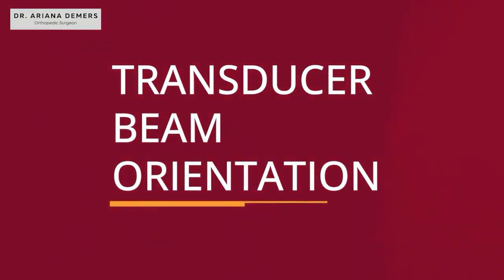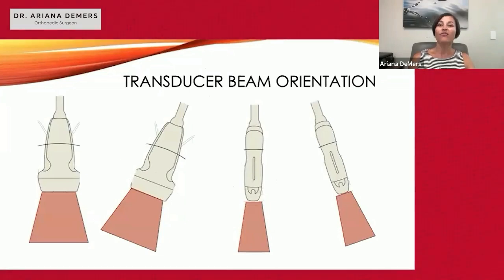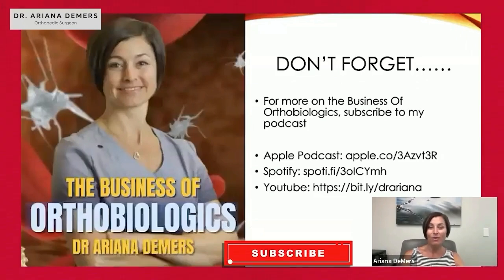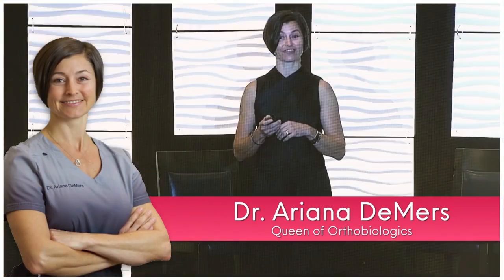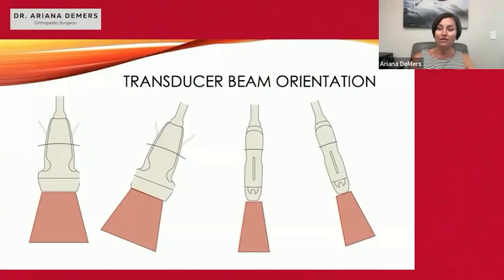I always think about the ultrasound probe as like a flashlight — this is transducer beam orientation. The linear probe is pushing sound waves out, and you can see in a clear path directly beneath the transducer, just like a flashlight. You shine the waves or the beam to the location that you're trying to see underneath the transducer beam.